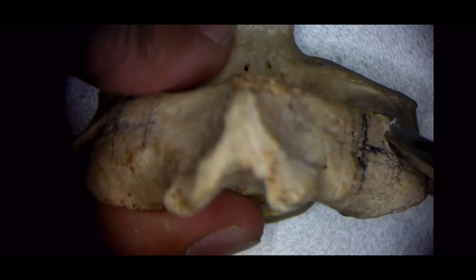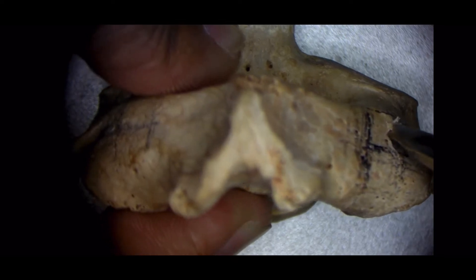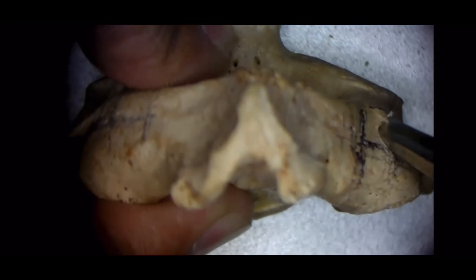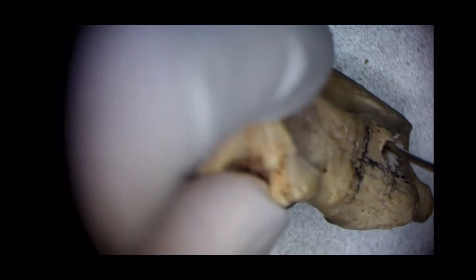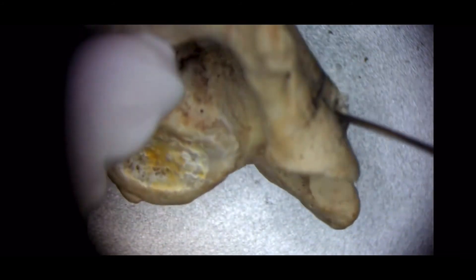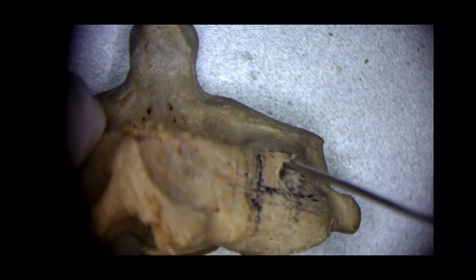The upper and innermost quadrangle is the pedicle entry point. The entry point can be chosen at the superior border of the lamina where it unites with the pars interarticularis. Just below that, you can make a pilot hole and then feel it by probe to check whether there is any breach in continuity or not. That is the entry point for the transpedicular screw in the cervical vertebra.